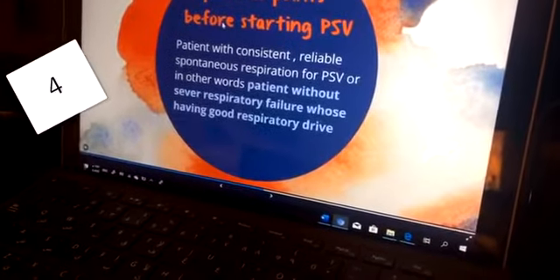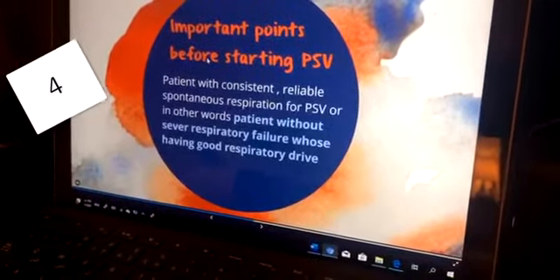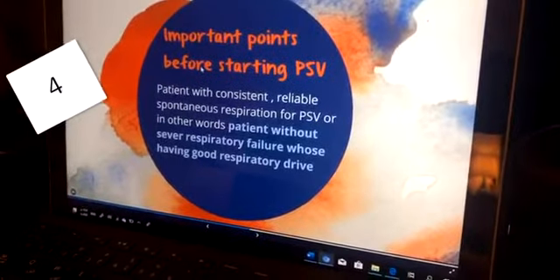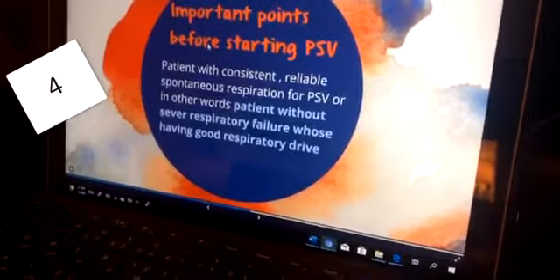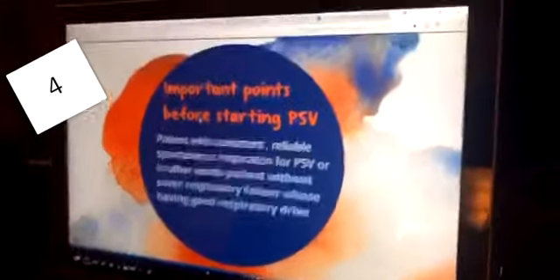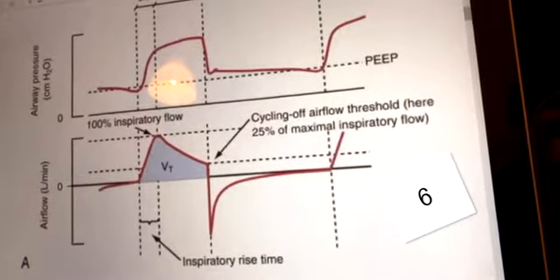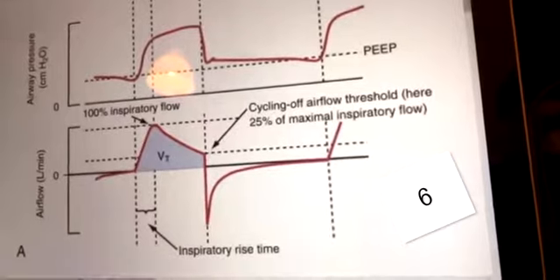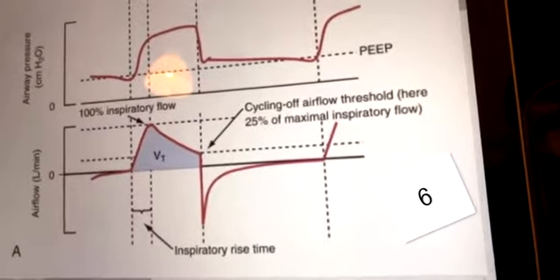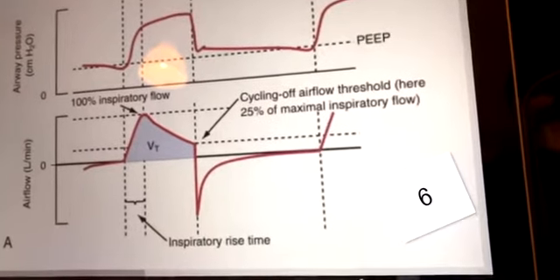Also, I need to know that when I'm using a pressure support mode and there are any changes in the mechanical properties of the lung or thorax or the patient effort, my delivered tidal volume will be affected. So after that, my expiratory phase will start and my PEEP will be applied in this phase. After that, we will finish a complete breath, inspiratory and expiratory phase, and so on.